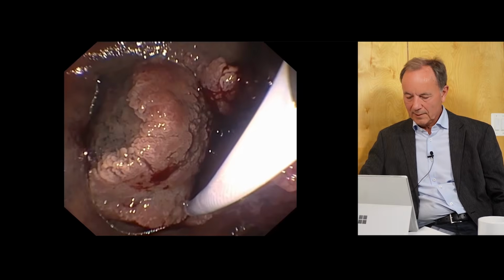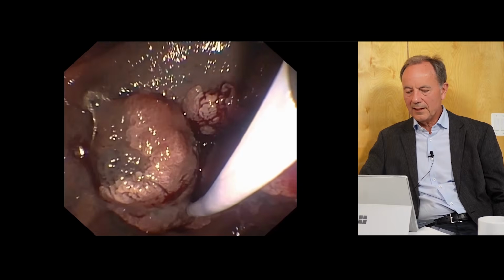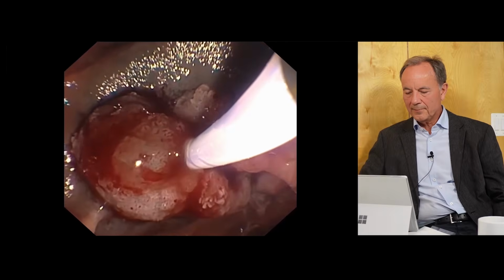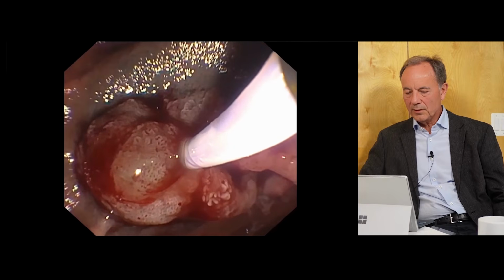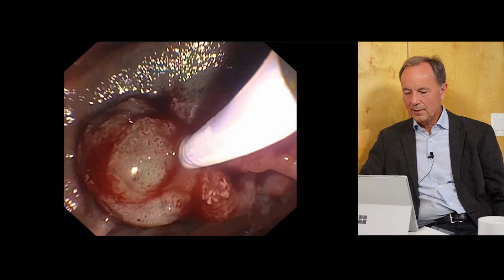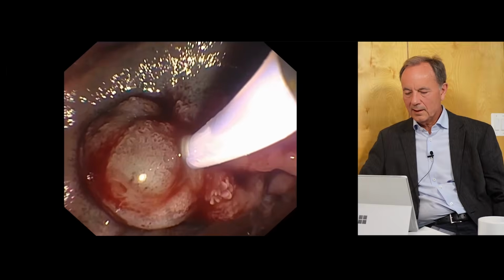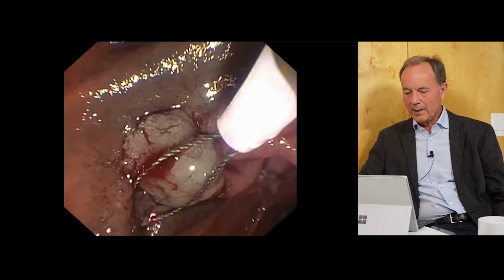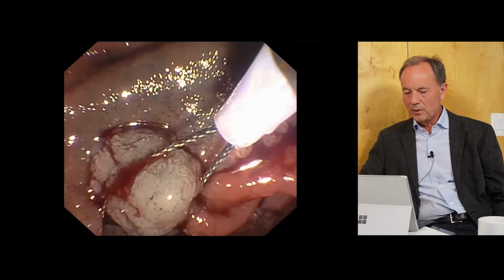Same principle as above. Yes. And then again, we close the snare tightly and use Endocut 2 to 4, and we harvest the specimen. So we can just leave it in the duodenal bulb.